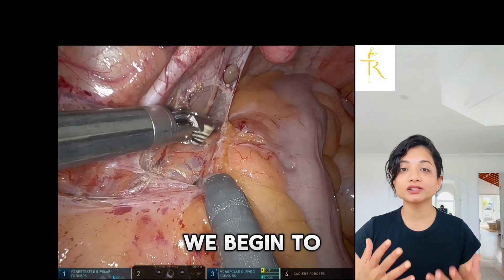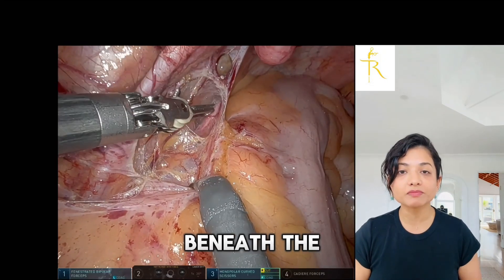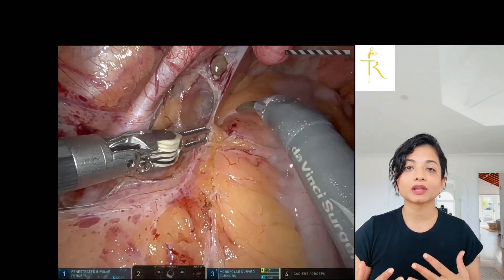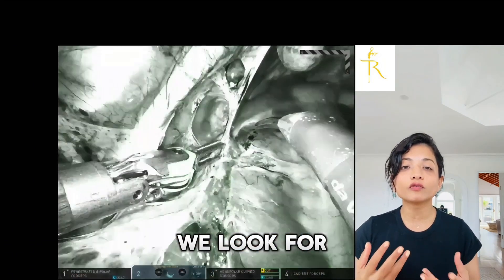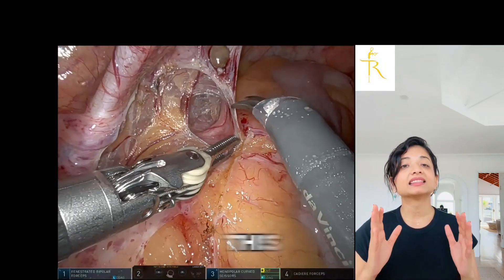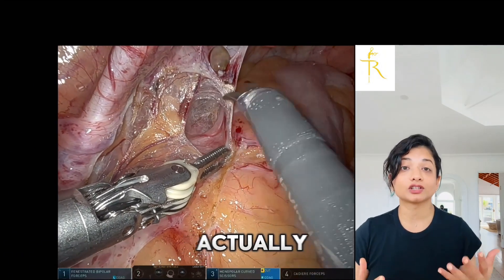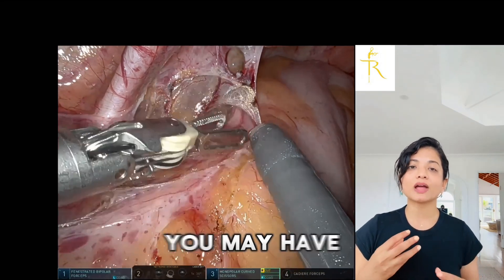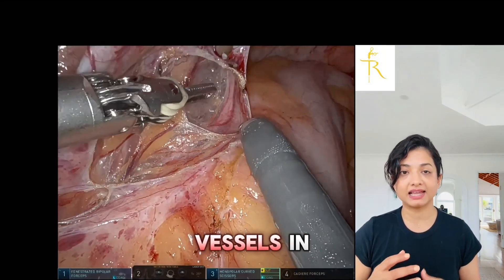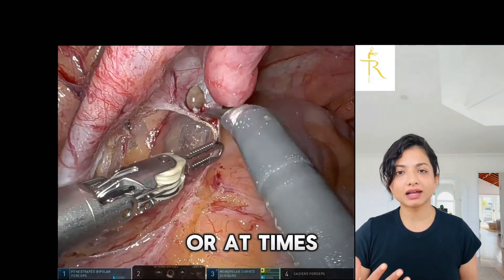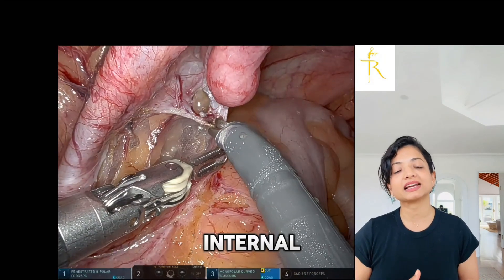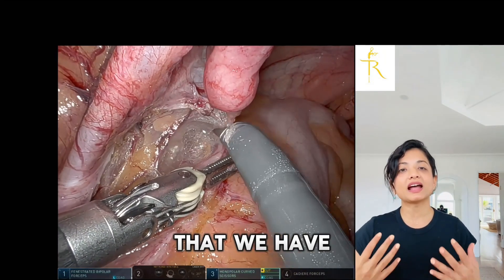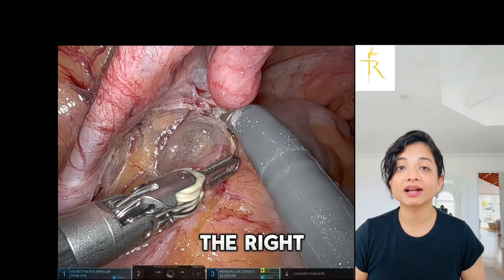Identifying and safeguarding the ureter is critical as we continue. We begin to see the ureter emerging beneath the mesocolon. To ensure safe dissection, we look for peristalsis — this confirms that we've actually found the ureter, because at times you may have blood vessels in the broad ligament or the internal iliac, so it's really important to ensure that we have identified the right structure.